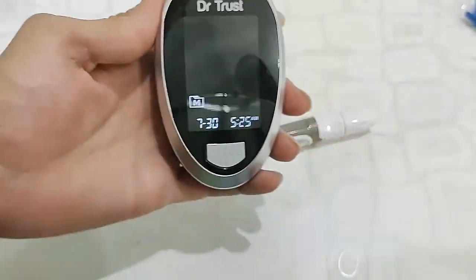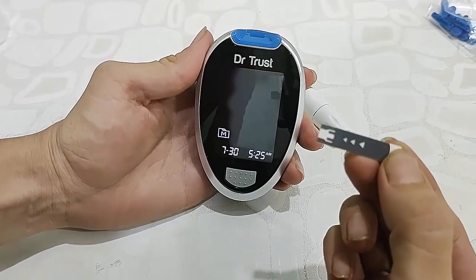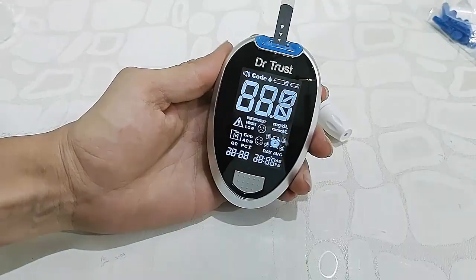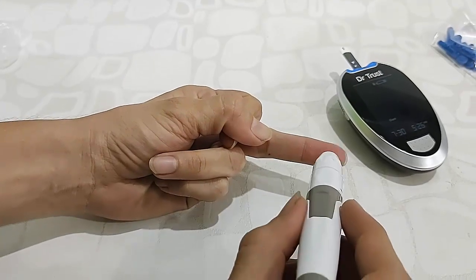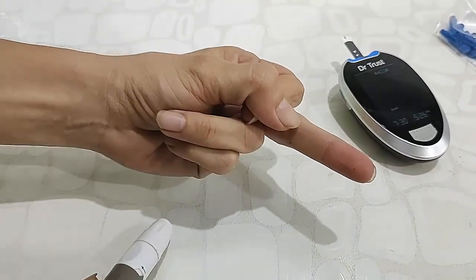Now turn on the machine and insert a test strip. Then place the lancing device on your finger and press the button — that's it.